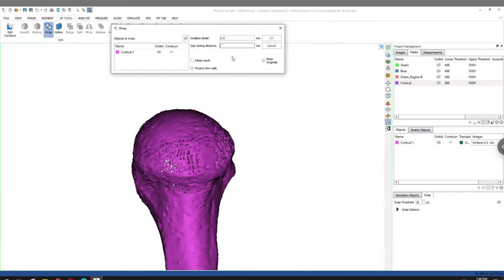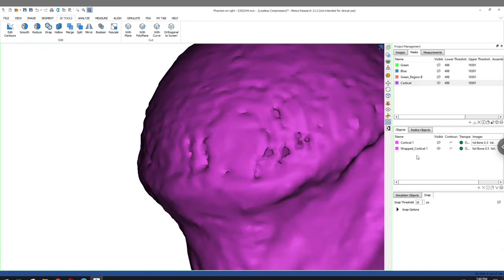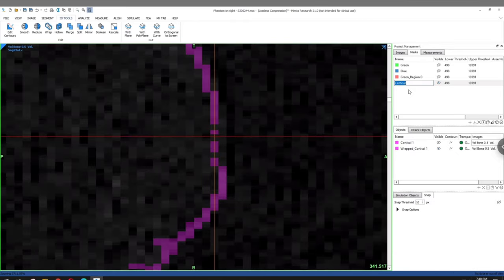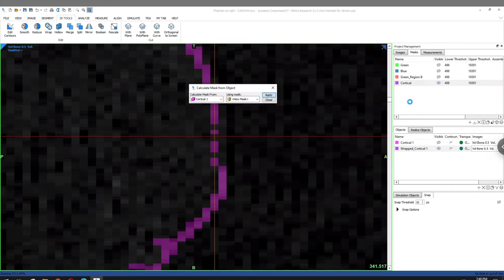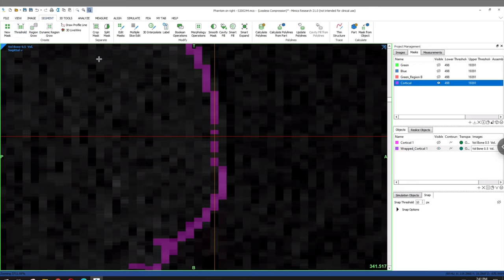As far as this process itself, we're looking to see where the largest voids still are in our mask, and then we're going to jump back into our CT images to segment further the mask that generated this 3D image. After clicking on the location of interest in that 3D model, we're jumping back into our sagittal plane here. Although in the coronal plane we really did our best to make a complete cortical shell, you can see here in our sagittal plane, unfortunately, there are still quite a few voids.